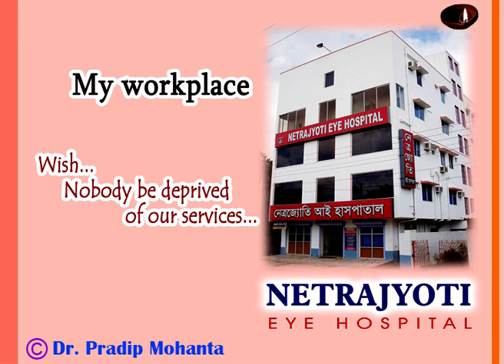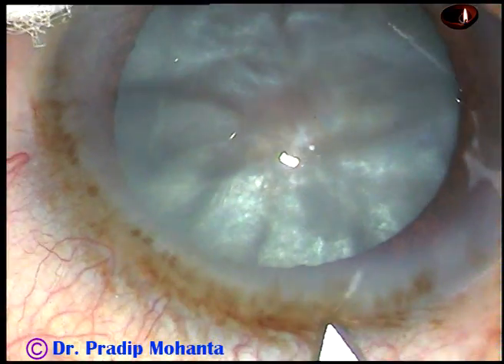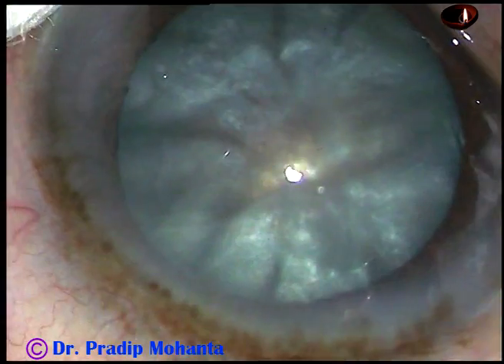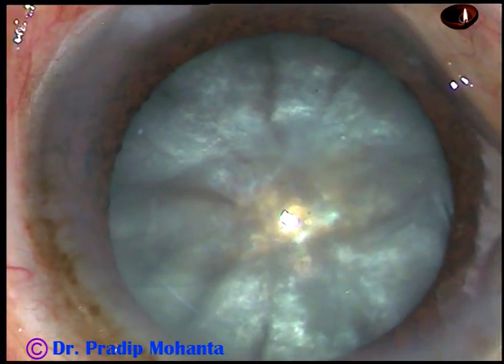Friends, welcome to my workplace at Ranagh Heart, West Bengal, India. This is an intumescent cataract with a very hard nucleus. Let us observe the management of this case.